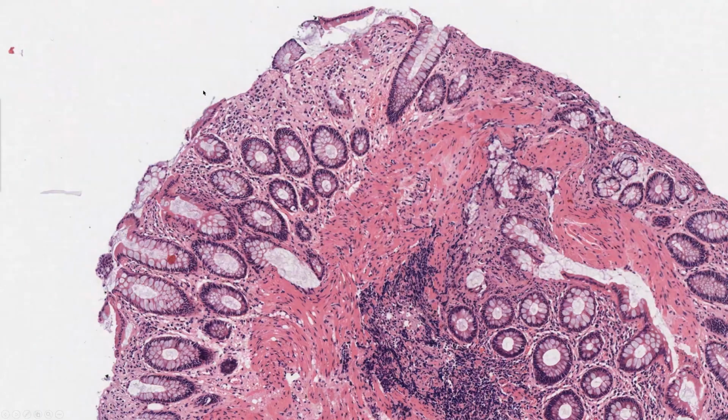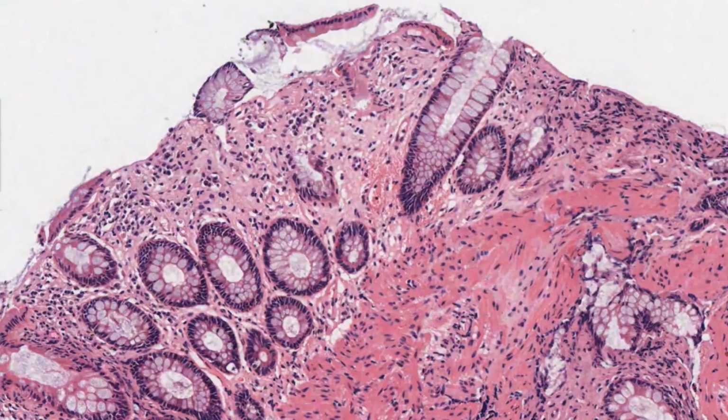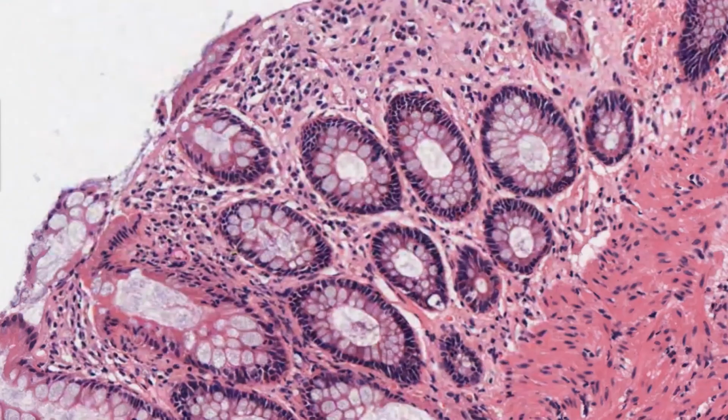It is as if someone took a scalpel and pulled off the epithelium, stripping it off. That stripping off of the epithelium is not a feature that I will take lightly. Never, ever. I will never take that lightly, and just remember that, right?